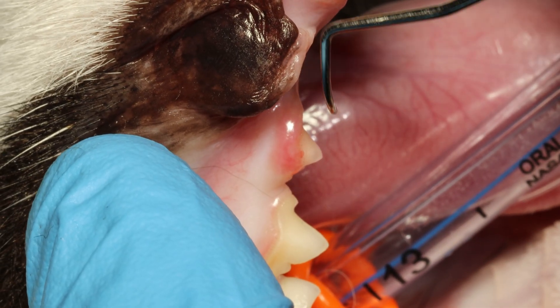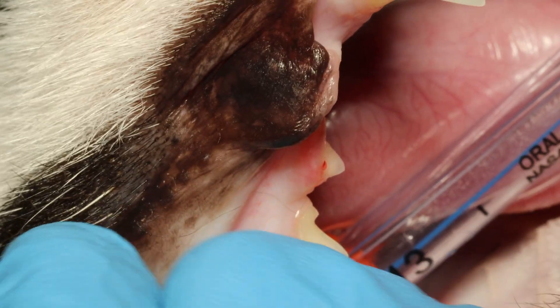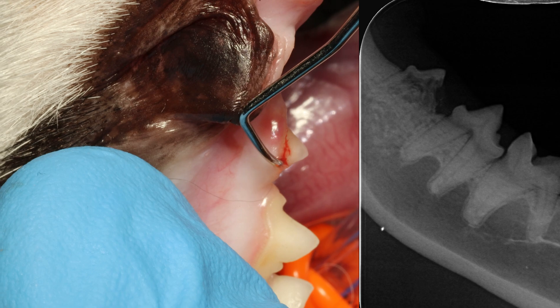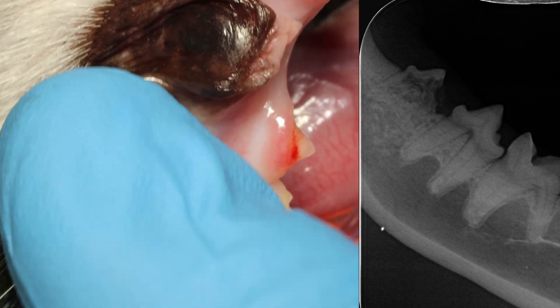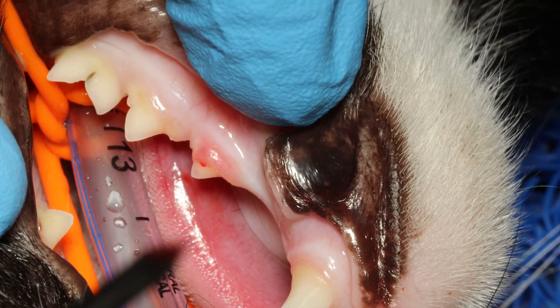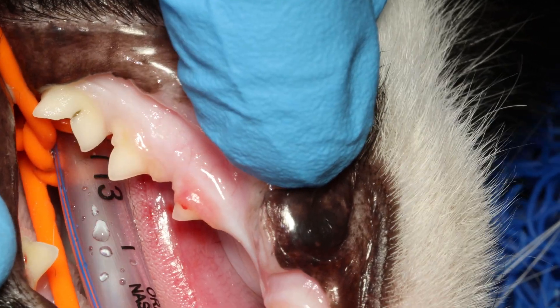This is a type 2 tooth resorption and you can feel the defect on the crown with your explorer. By looking at the x-ray you can see that the roots are being replaced by bone. Type 2 tooth resorption is also called replacement resorption because the roots are gone and there is now a detectable defect on the crown.